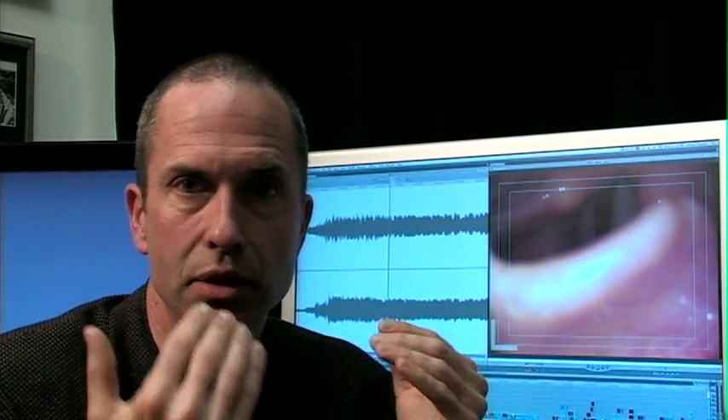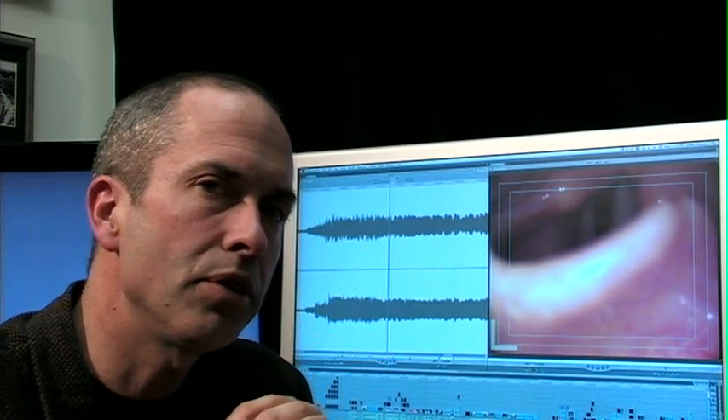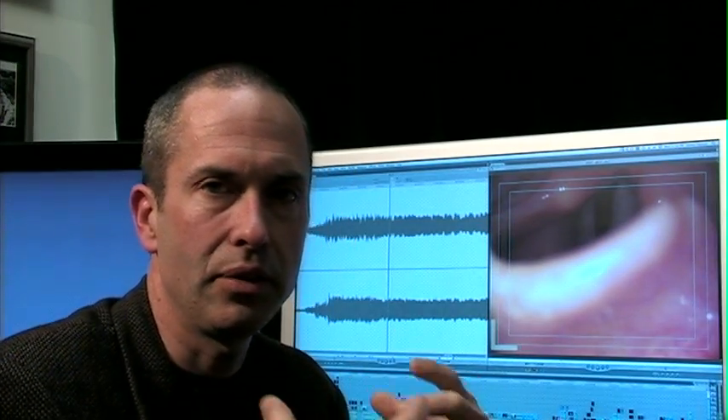One of the other issues with the rigid endoscope is that it's a fixed perspective. It goes in the mouth and you can't really move it around — you end up looking straight down on the vocal cords from one perspective. And sometimes that can fool you a bit. Here's a patient I examined with the rigid endoscope and then with the flexible, and let's see what detail the flexible adds.